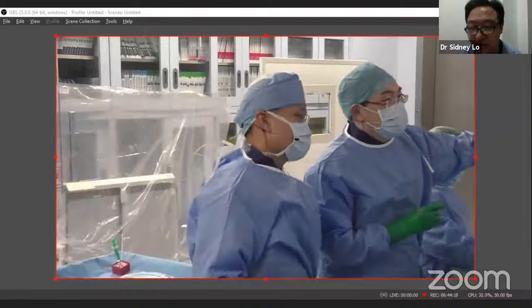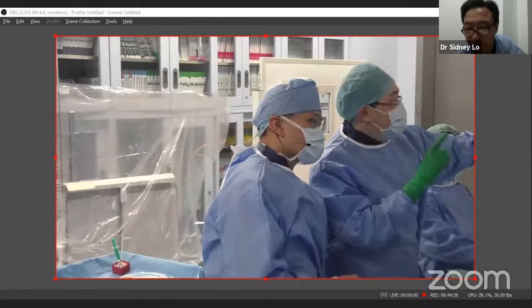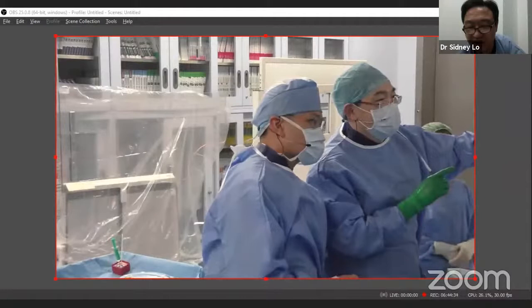And of course, you're aiming for those numbers you've heard from Dr. Jang, 5, 6, 7, 8, and maybe a bit bigger in the left main. In EXCEL, it was more than 10 millimeters in the left main. You want to get a good minimal stent area for reducing event rates long-term. So, translatable from the trial. Again, people keep emphasizing imaging.